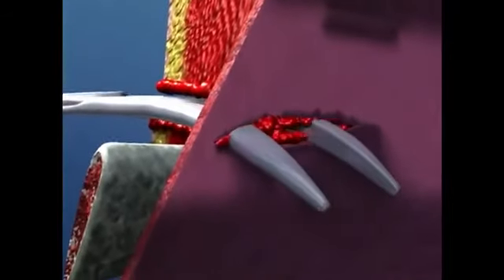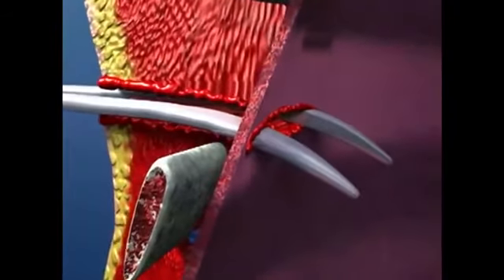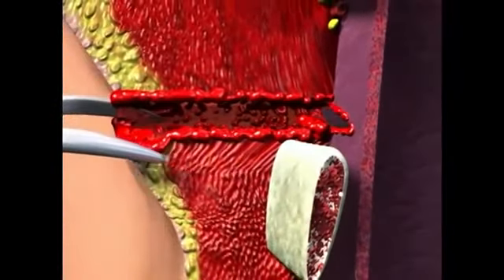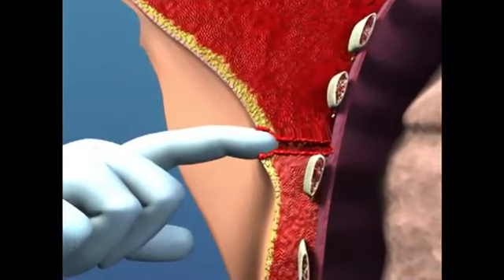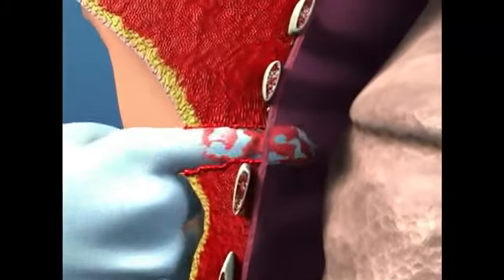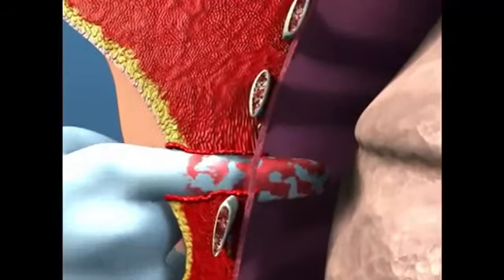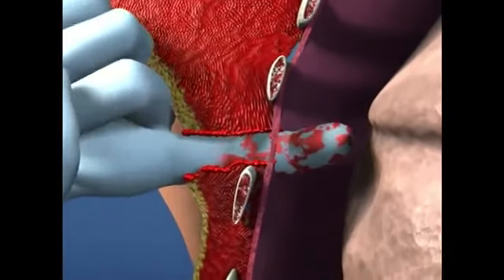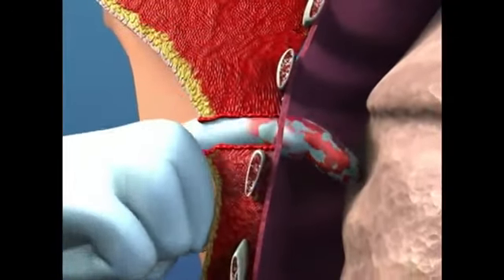Once inside the pleura, spread the hemostat widely and withdraw it while still open to create a sufficient opening in the pleura for the chest tube. Before inserting the chest tube, place your finger into the hole of the pleura. Move your finger around 360 degrees to confirm correct location in the pleural space by feeling the lung and making sure that there are no adhesions or impediments to placing the chest tube.